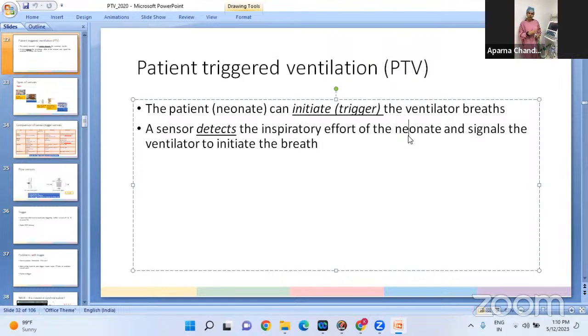Now, when we have a diaphragm, the important difference in comparison to the other valves is because it moves to and fro, even expiration becomes active. Whereas in most conventional modes of ventilation, expiration is a passive process promoted by the elastic recoil of the patient's lungs and the intercostal muscles. So only in diaphragm, the diaphragm moves towards as well as away from the patient. Thereby, it sucks gas out of the lungs during expiration, and hence expiration also becomes an active process.